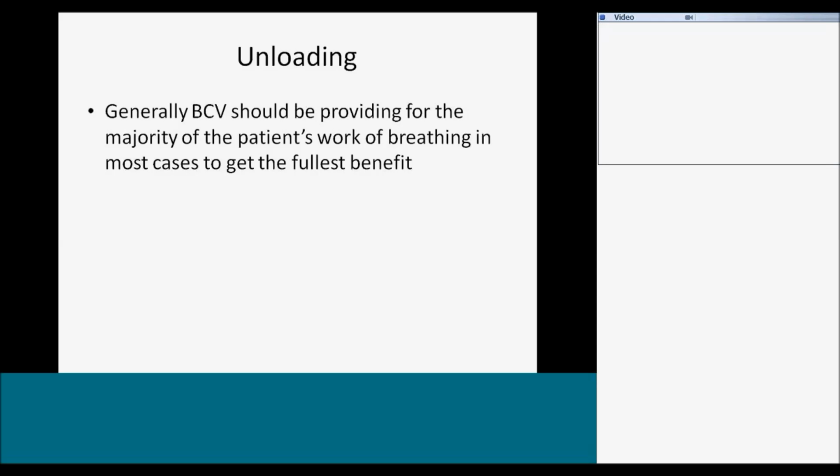Now, our goal for setting selection for BCV is to unload the patient. That's our biggest goal. So the patient should basically, in control mode, relax and allow the machine to lift up the load and take up the work of breathing. The idea being that if we completely unload them, then when they need to breathe on their own and perform ADLs, because the majority of our patients do have some respiratory drive and the ability to generate a tidal volume, that ability will be enhanced by good rest periods on BCV.